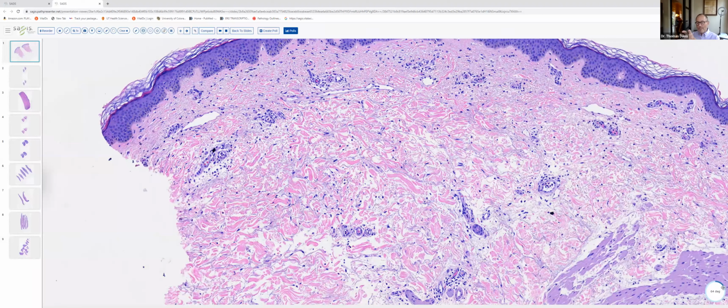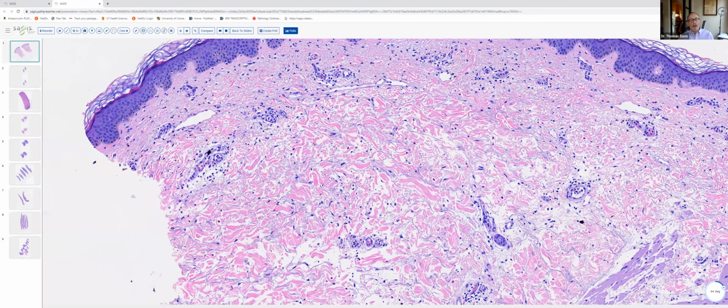Now, a couple of points about urticaria. Chronic urticaria, as you're aware, is frequently biopsied to rule out urticarial vasculitis. But you can see in this particular specimen, there's no evidence of small vessel vasculitis. There's no fibrin in the vessel walls or lumina of these postcapillary venules. There are really no extravasated erythrocytes and not much in the way of neutrophilic nuclear dust.